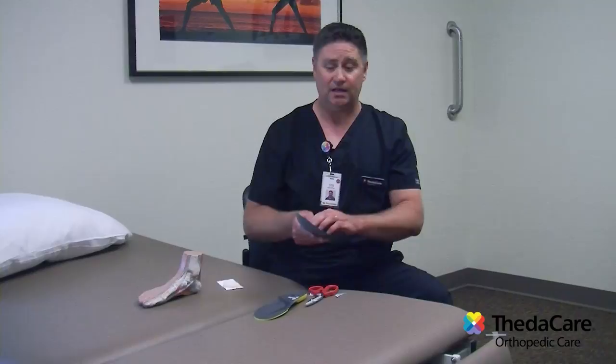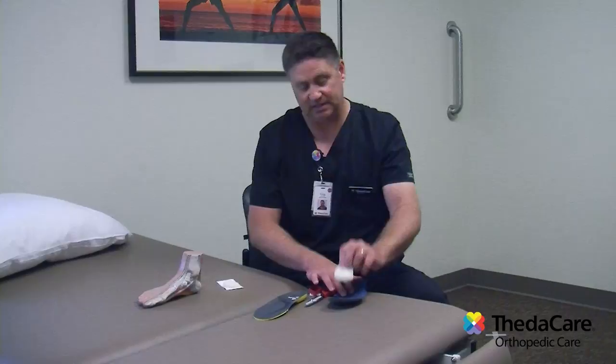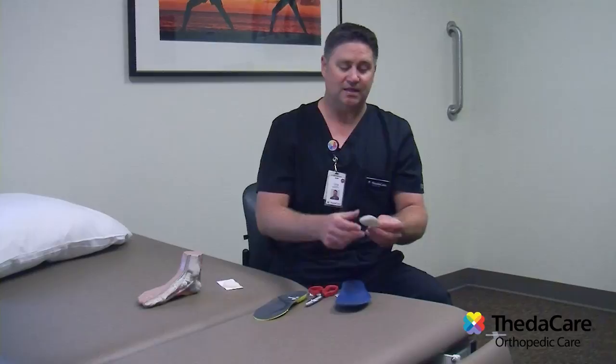Now take this and put it inside your shoe and wear it for a few days to see how it feels. If it feels great and it's in the perfect spot, what you'll do is take a Sharpie and go around your metatarsal pad, then take the backing off and stick it directly to the insole. That way, once you take that paper off, it's permanently stuck to your insole. If you just think you got it in the right spot and stick it right away, you may need to adjust it.